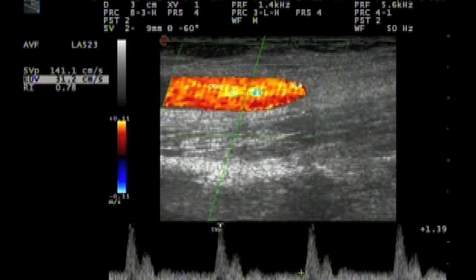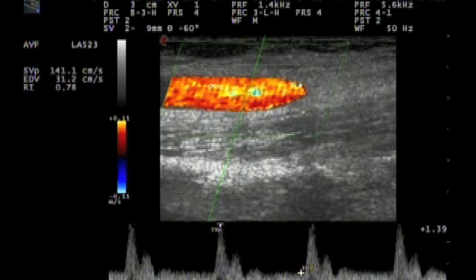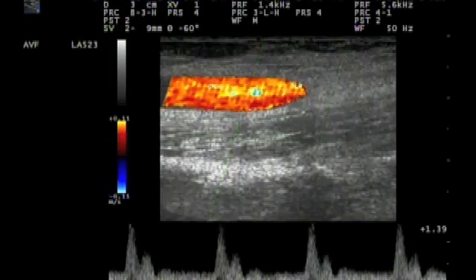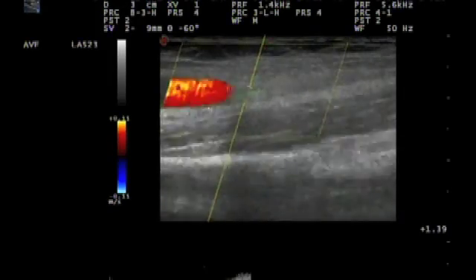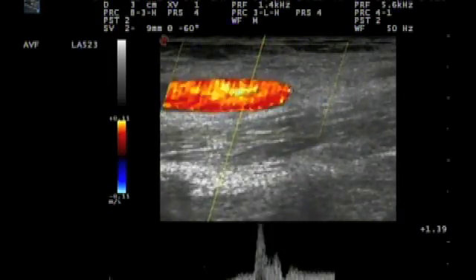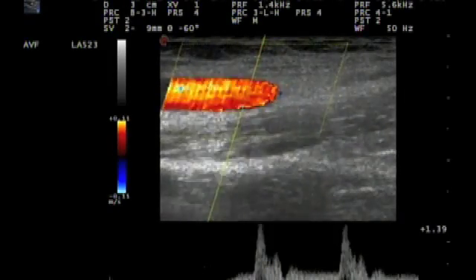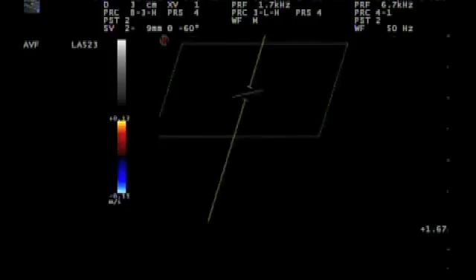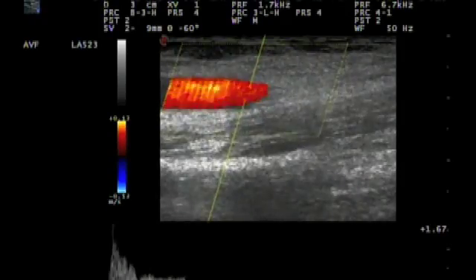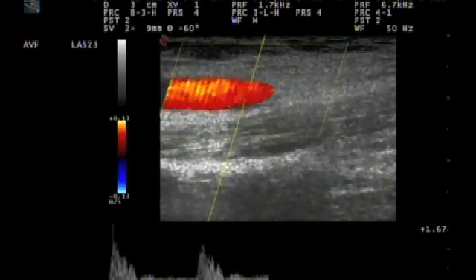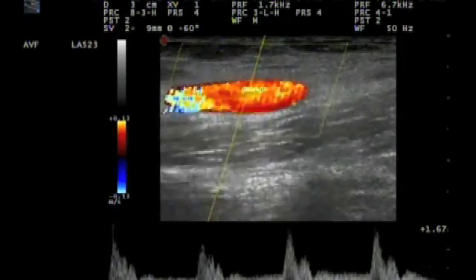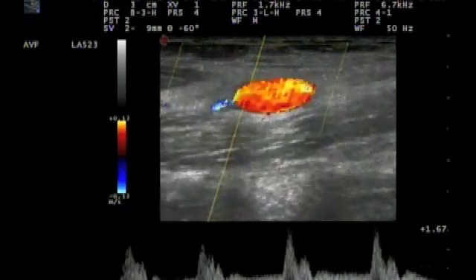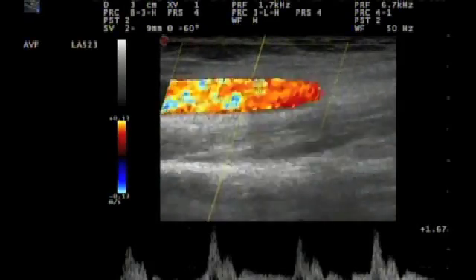And here we measure the resistive index. We have here a value of 0.78, which is fairly high. Normally we would expect at this point an RRI around 0.6 or lower.